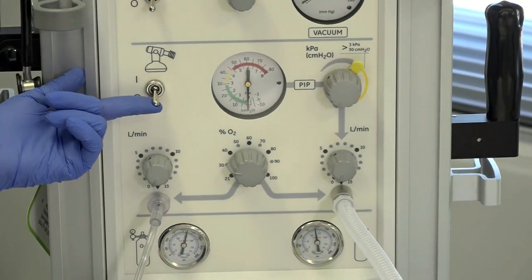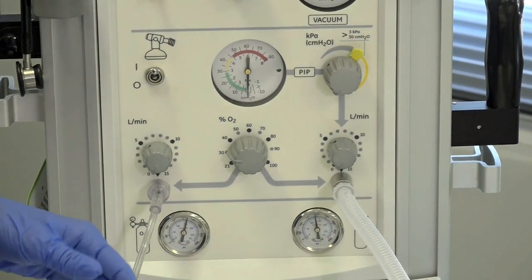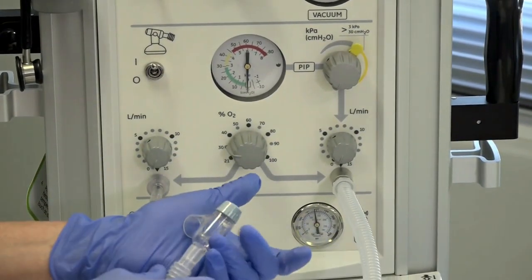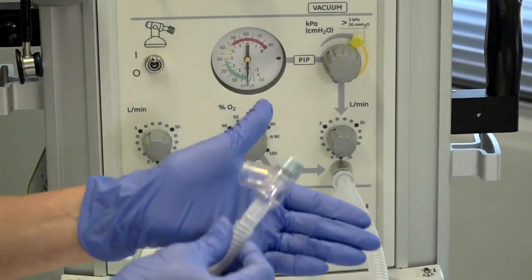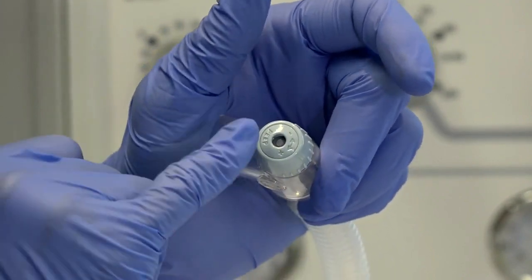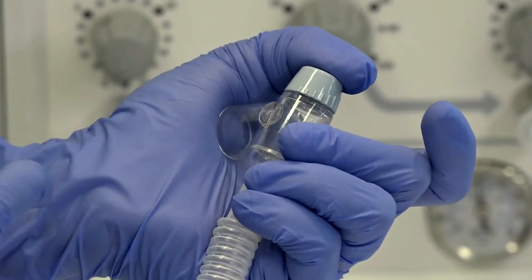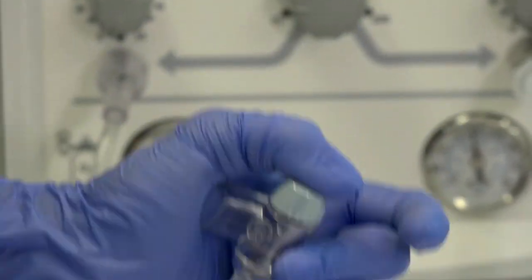We need to turn the toggle switch on. You take the T-piece, occlude the ventilation outlet, and occlude the PEEP bulb — I've put my thumb over there. It will come with a little cap on it, so you don't actually have to hold it like that.